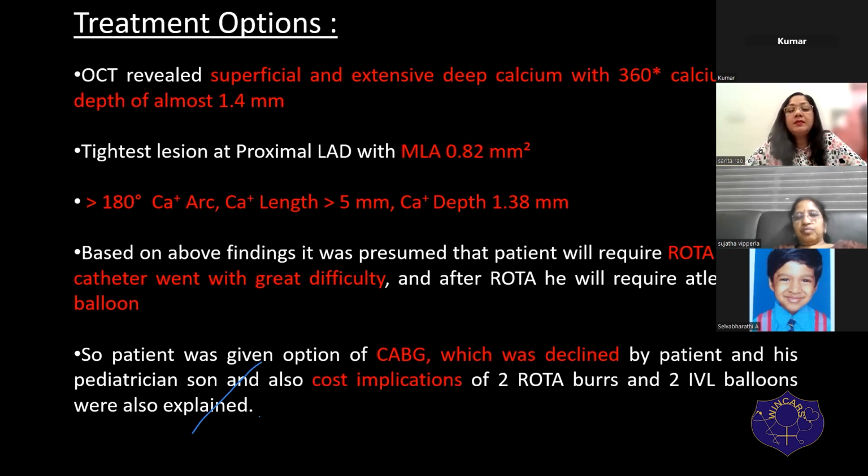Now, this is the time that orbital had just been introduced into India. And this was actually the first case of orbital that I did. Now I'm a certified proctor, but this was the first case of orbital which we did.